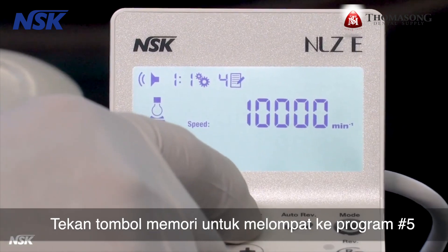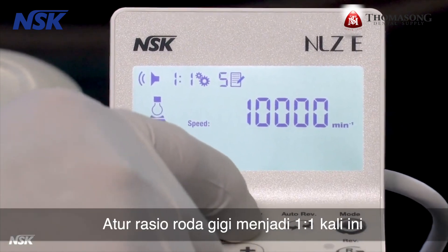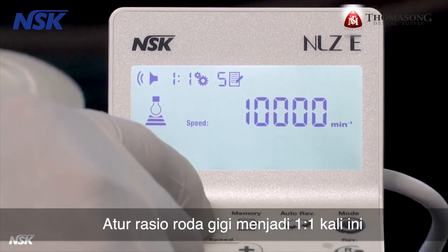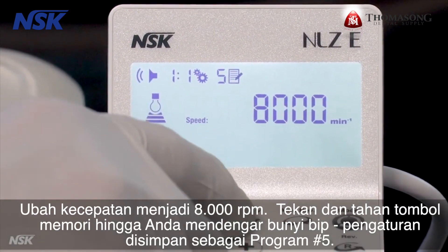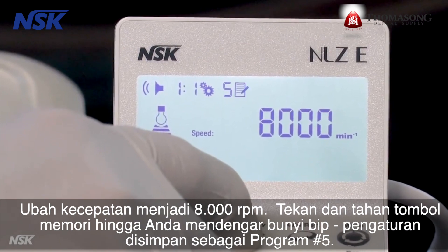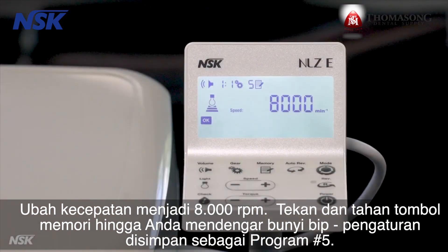Press the memory button to jump to program number five. Set the gear ratio to one to one and change the speed to 8,000 RPM. Press and hold the memory button until you hear a beep — the setting is stored as program number five.